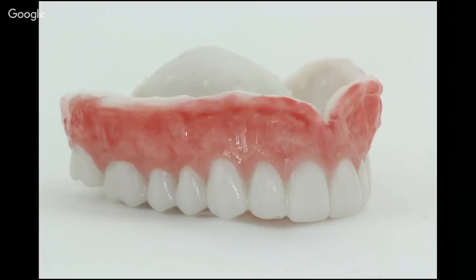And so you can see this is starting to look like a much more lifelike gingiva. Now the teeth are monolithic. That's the only downside as far as I can see with this technique: inherently, if you're printing the teeth, they're going to all be one shade, one consistency through and through. So you are giving up a little bit on the aesthetics as far as translucency, unless you went in and added staining and cut back or whatever like that. But the trade-off is you're getting a monolithic denture, and this stuff is strong.